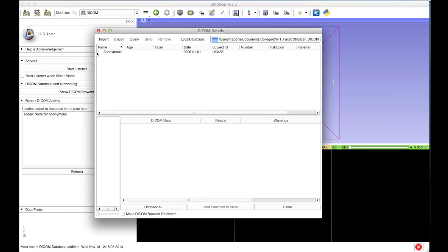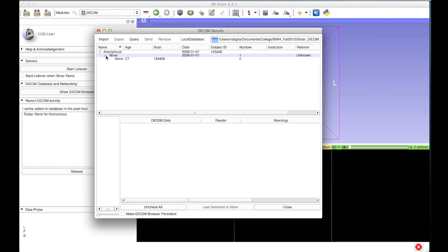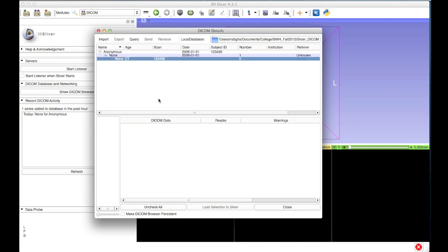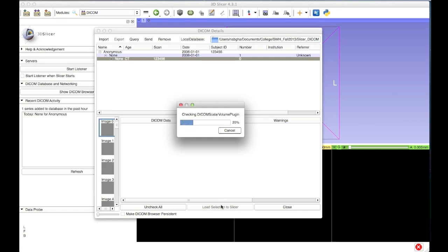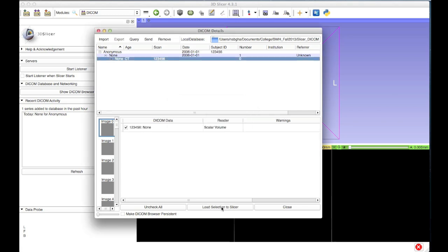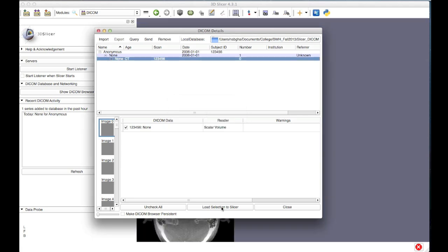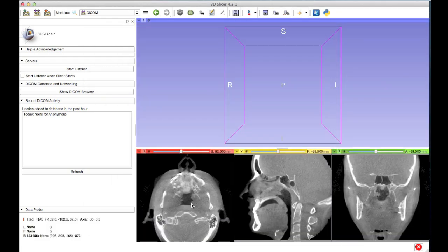You can see now that I have this new patient in my browser named Anonymous, and a new study for that patient named None — which might normally be a date or other information. All the series for that study will be listed below. I only have one, so that's my cone beam CT. When I click on it, Slicer will first check for the appropriate plugins, and once that's completed I can click load selection to Slicer. And it's really that simple — now my data is loaded into Slicer.